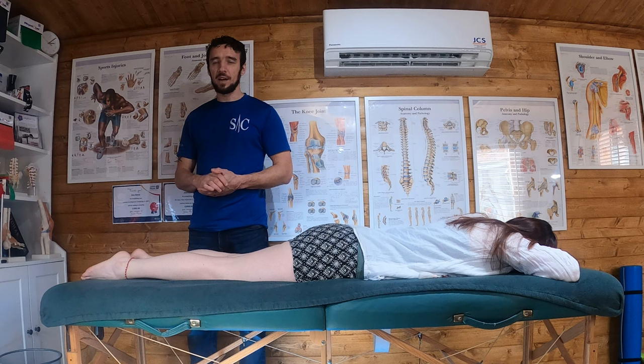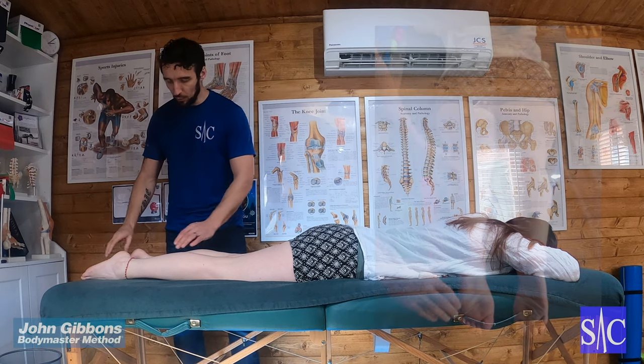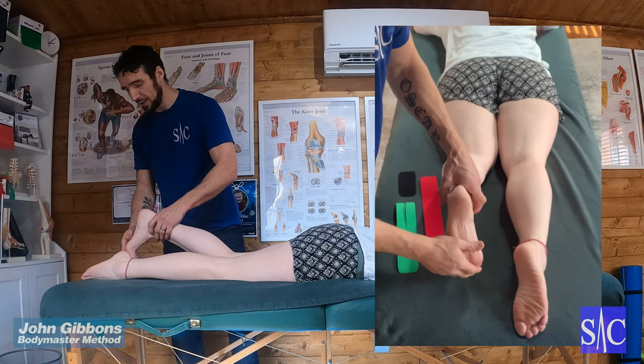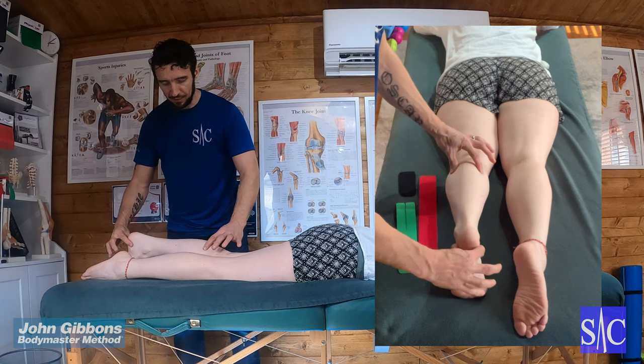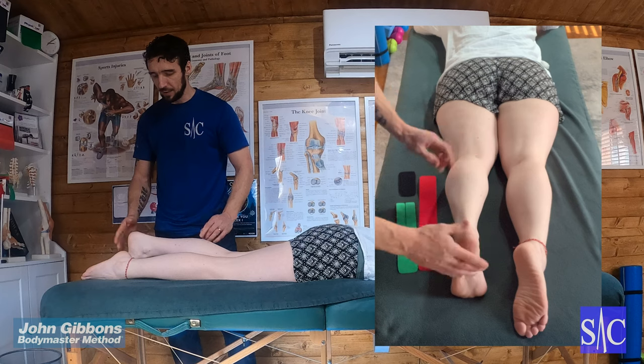This is a taping technique — a calf taping for Achilles tendinopathy. What we're going to do is take this left calf, bring the foot up, tuck the toes, and have the foot and leg in this position to get lots of stretch through the muscle and the tissue.